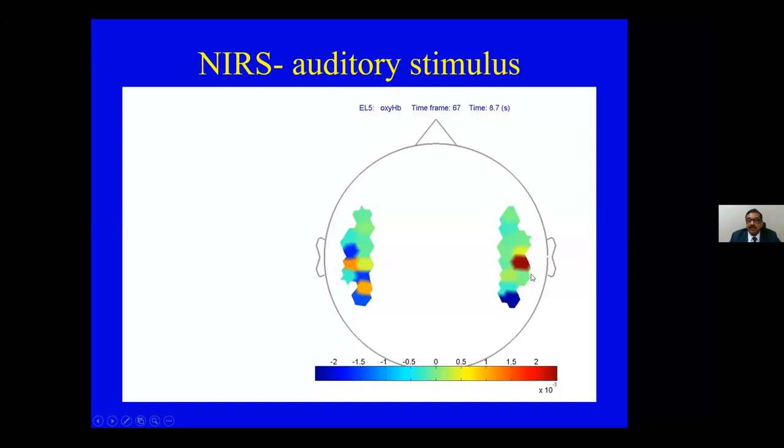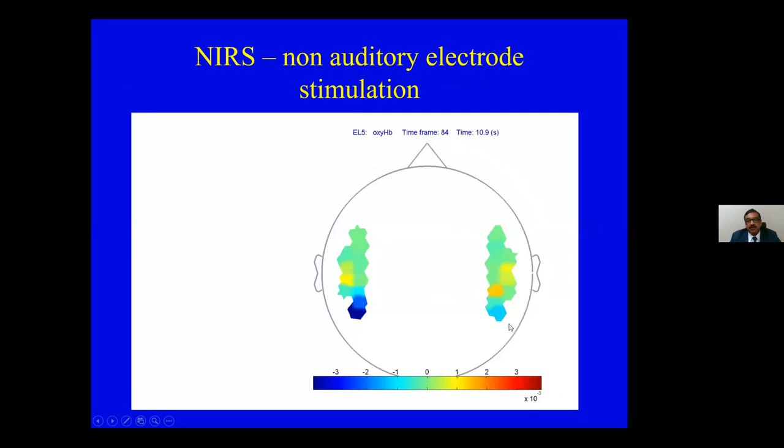So this is a good tool for assessing in a child whether he's had a cochlear implant or a brainstem implant. The advantage is, unlike MRI, this is compatible in a child who's had an implant. This is a person who's had a brainstem implant but there's no alteration. So you know that this electrode is not functioning. But this is a child who had a revision.